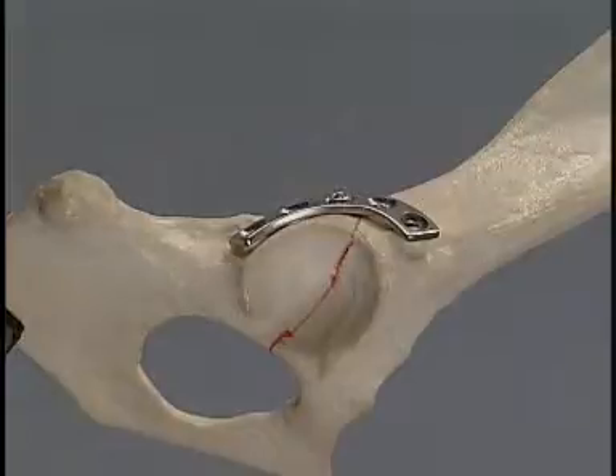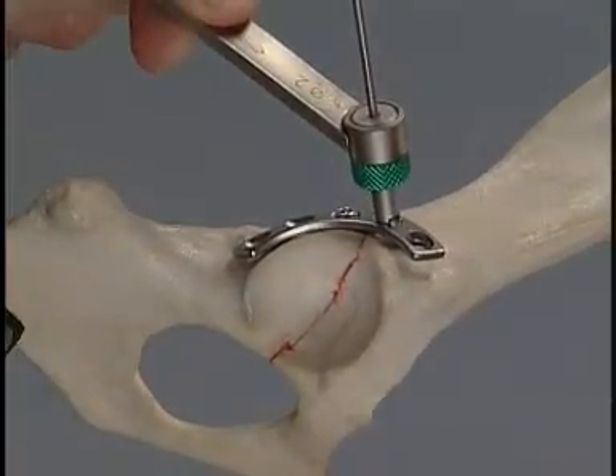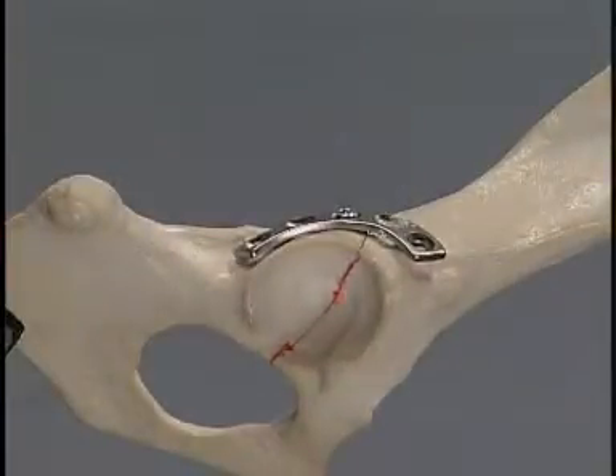Using the green neutral drill guide, a hole is drilled in the cranial acetabular fragment. Penetration of the articular surface of the acetabulum has to be avoided.